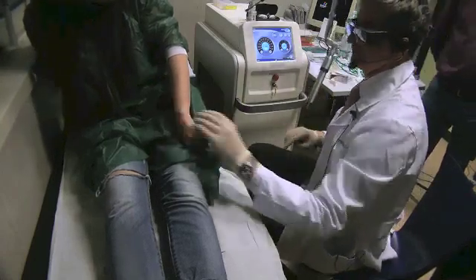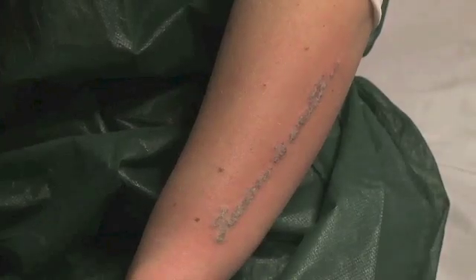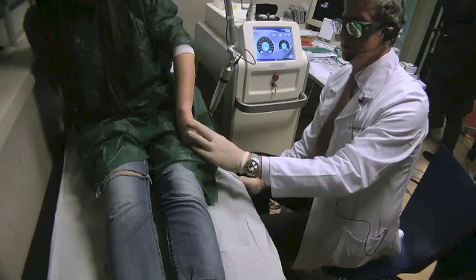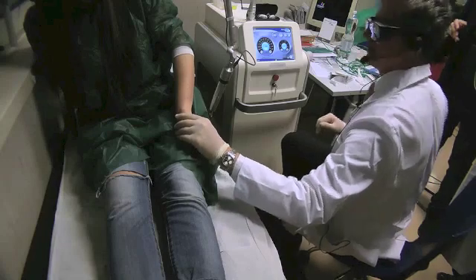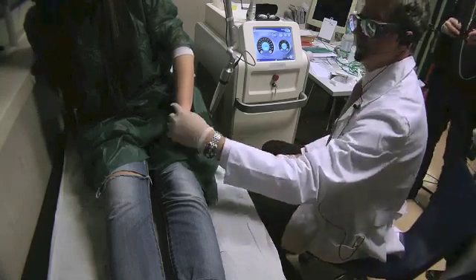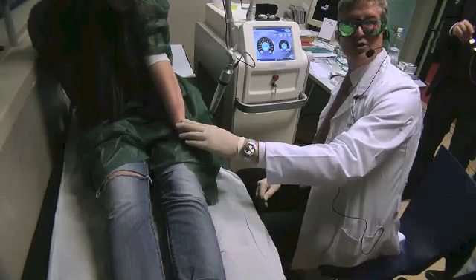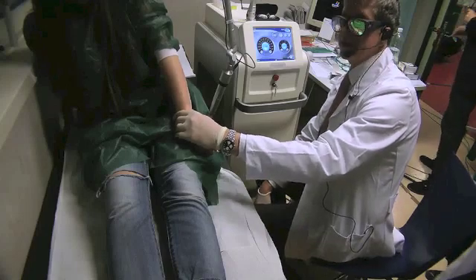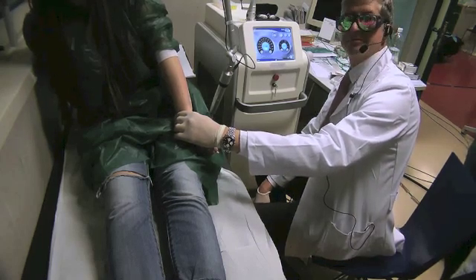We are done with this tattoo. Do you have questions? Questions from the audience: is there a difference in the vasculature if you compare nanosecond to picosecond? In terms of skin damage — yes, of course. Pinpoint bleeding is an endpoint in nanosecond treatment. Here we have only erythema or petechiae, but absolutely no bleeding as an endpoint.